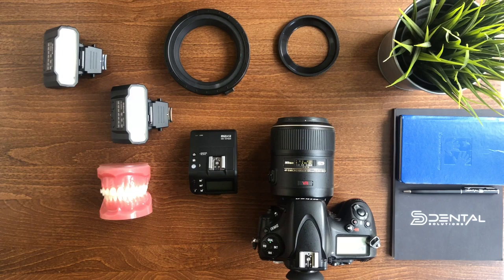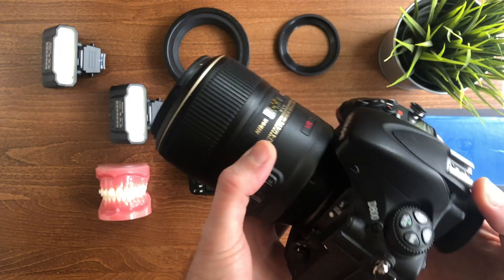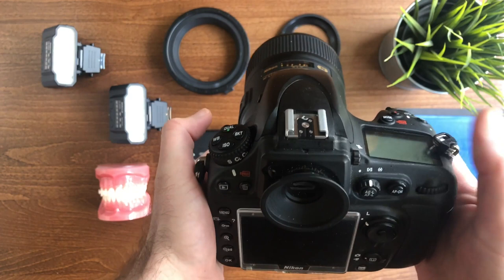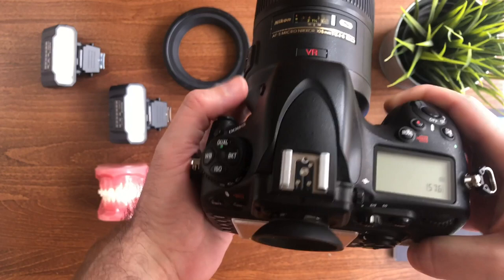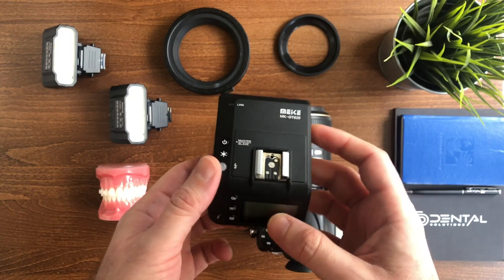Okay, so this is the equipment we are going to use today. This is my main camera — it's a full-frame camera, the Nikon D800. It's a little bit different from most other DSLRs that are less expensive. The main difference is that I have one dial and no knob here. I will show you my settings and we will pretend that I just bought the flashes today, leaving everything in default mode.